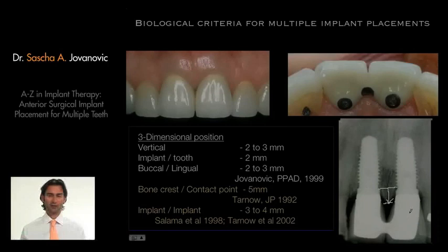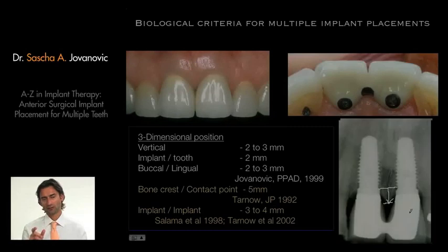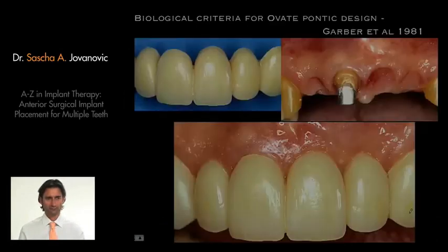The more we can increase it, the better it is, of course, because in tapered teeth, it can give us more gingival tissue. Now it's important to realize that this interproximal bone papilla is unsupported. So the only thing which supports it is actually the thickness of bone. Therefore, we need to have a lot of bone, and we need to also have sufficient distance. So bone needs to be maintained or respected or grafted. And the space between implants will maintain it. Now that's really the main point where the difference is between multiple teeth and single teeth.